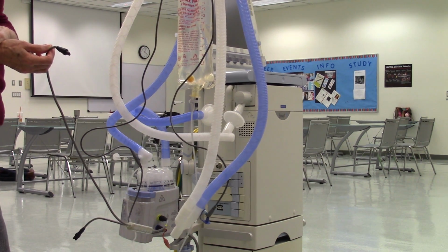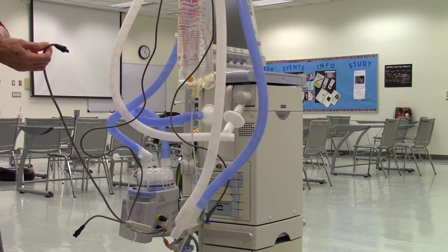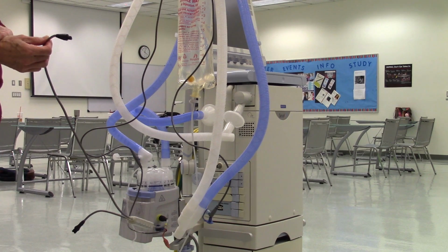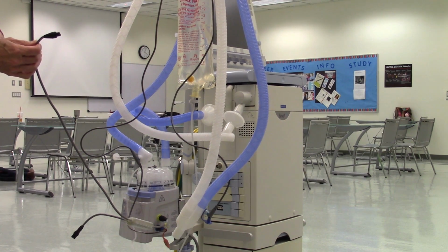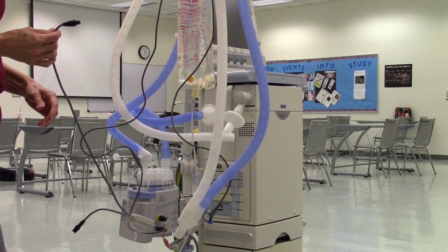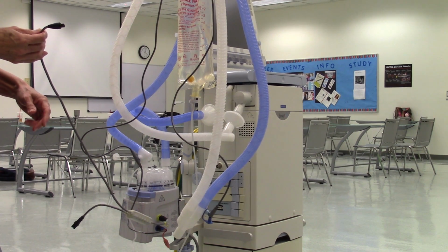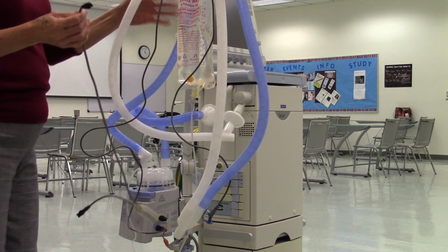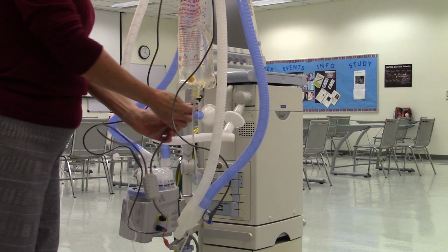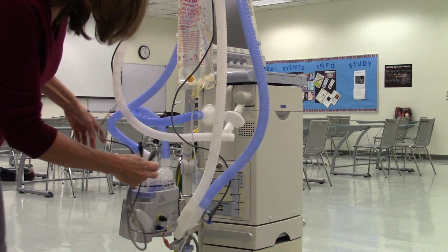It says the top connection, yellow, is the attachment for the heater cable. You'll notice the cable has two plugs. Attach one plug into the inspiratory side, the other plug connects to the expiratory side at the end of the tubing. These wires heat up the circuit. The purpose is to prevent cooling of the gas. All right, so this cable will heat the wires that are inside the circuit. And they're also shaped so they can only go into one spot.